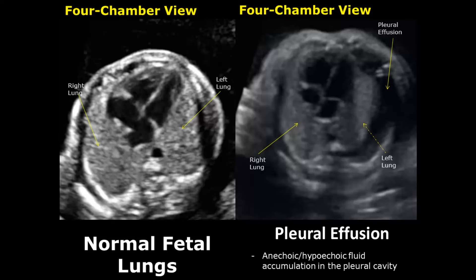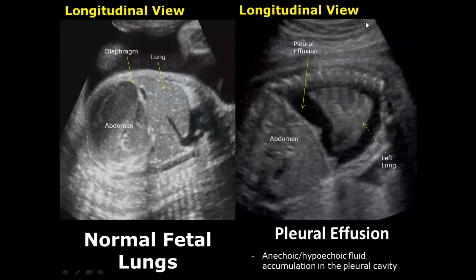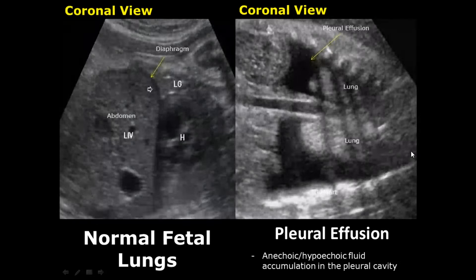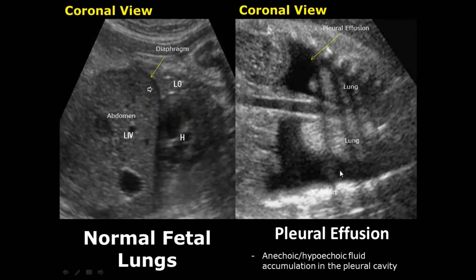Pleural effusion fluid appears anechoic or hypoechoic. Here we can see pleural effusion in the longitudinal view with fluid surrounding the lungs. In this coronal view, we can see bilateral pleural effusion with fluid surrounding both lungs.